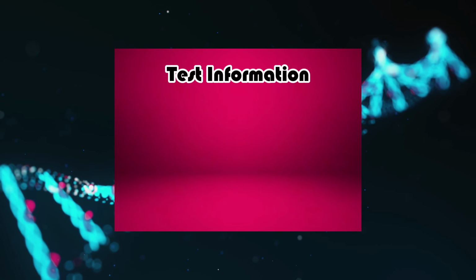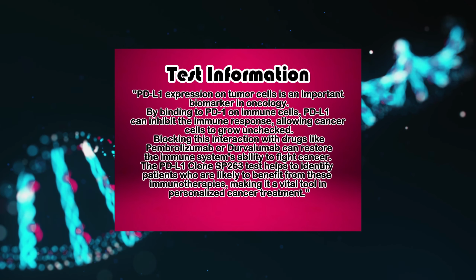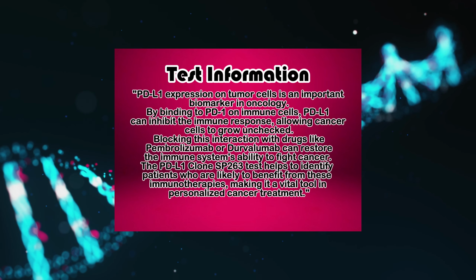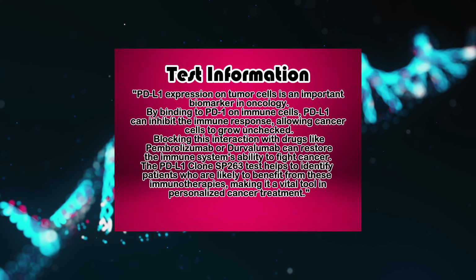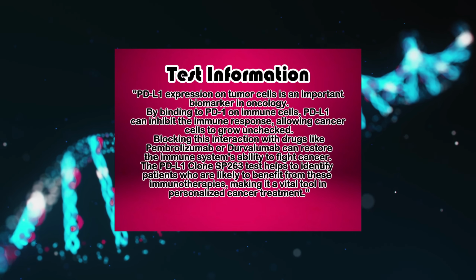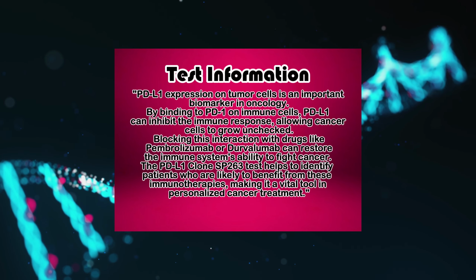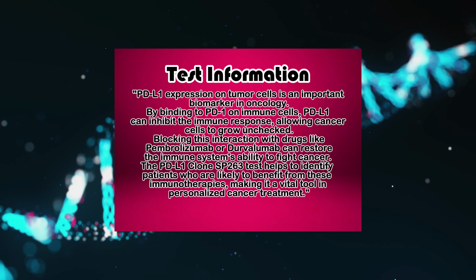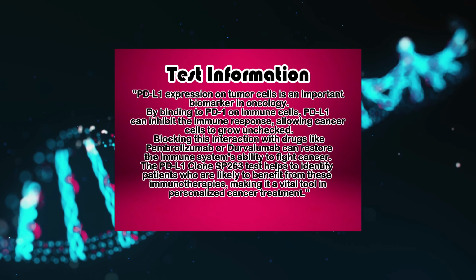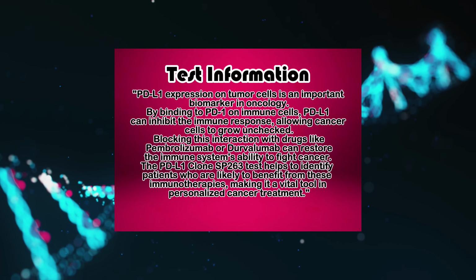Clinical significance. PD-L1 expression on tumor cells is an important biomarker in oncology. By binding to PD-1 on immune cells, PD-L1 can inhibit the immune response, allowing cancer cells to grow unchecked. Blocking this interaction with drugs like Pembrolizumab or Durvalumab can restore the immune system's ability to fight cancer. The PD-L1 clone SP263 test helps to identify patients who are likely to benefit from these immunotherapies, making it a vital tool in personalized cancer treatment.